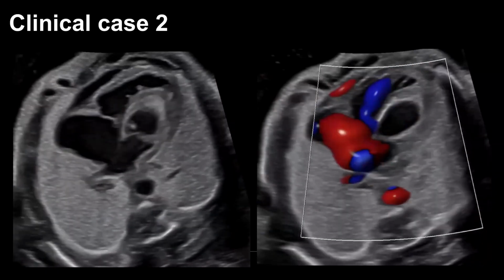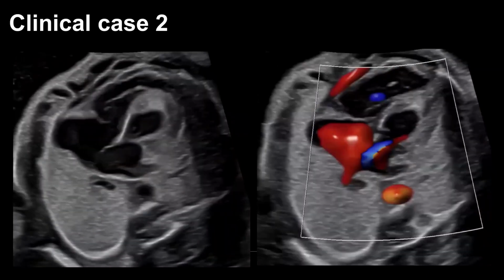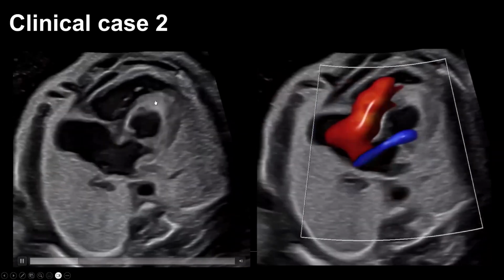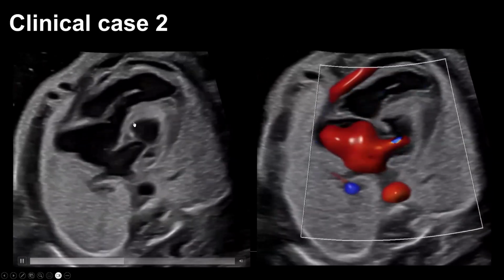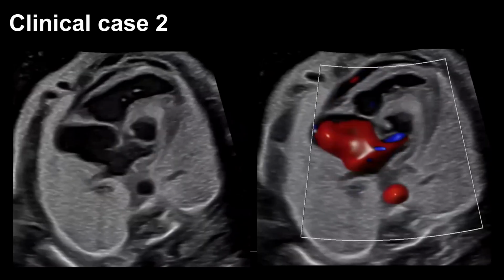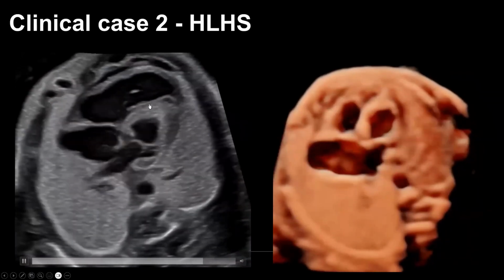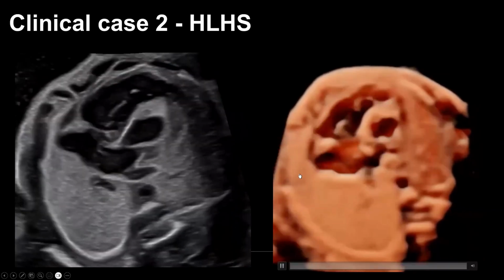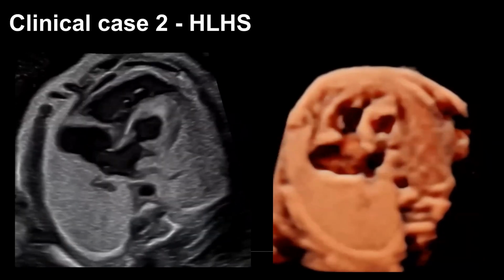This is the hypoplastic left heart syndrome that develops as a result of the critical aortic stenosis. And you can see the specific features of the left ventricle and its globular, not contracting, the echogenic endocardium. So this is really, really severe cardiac anomaly. And here I would like to highlight that this is something that we can use the 3D and reconstruct the same features of this heart defect.